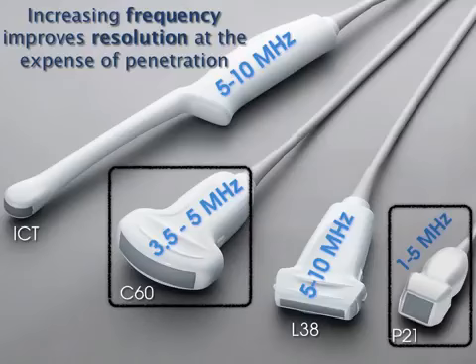Intracavitary transducer, yeah, you can see the bladder from within the vaginal vault, but it causes a lot of artifacts because the curvature of this probe is so tight. There's a lot of artifacts that come off that. In fact, we always recommend that women have a completely empty bladder whenever we do an endovaginal ultrasound. And unless somebody's really thin or they have a really full bladder, it would be hard to see the bladder with the L38, especially in an average size or larger format human being.